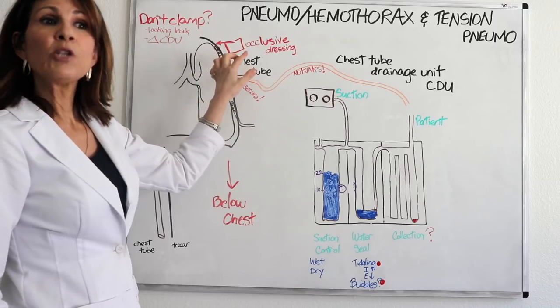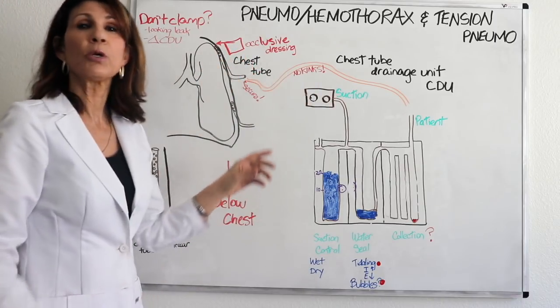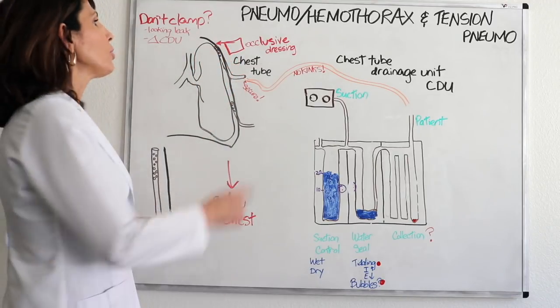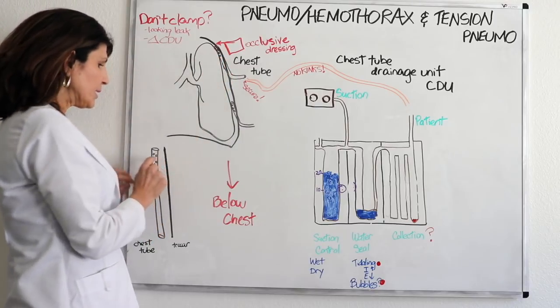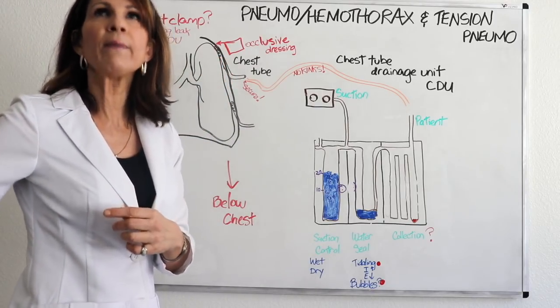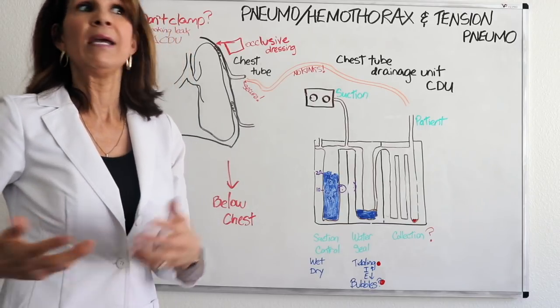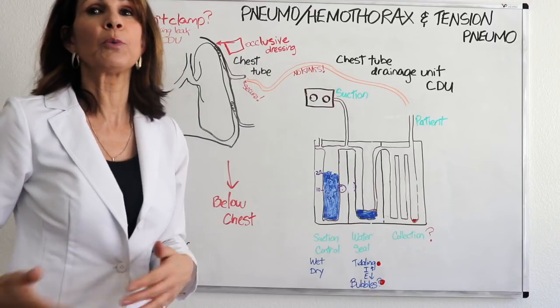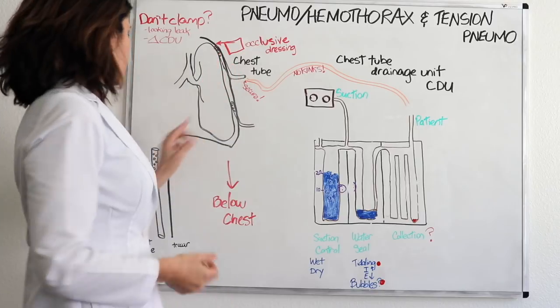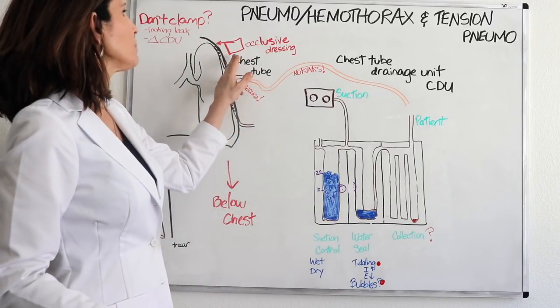Also, another potential place where a leak could occur and air could go into the pleural space is at this chest tube insertion site. So first of all, make sure that you don't see any of those little holes stick out, because if you think about it, that's going to allow atmospheric air to go right back into the pleural space. Even if you're resolving a hemothorax, you don't want to cause a pneumothorax on top of that. So those little holes need to be securely in that pleural space.